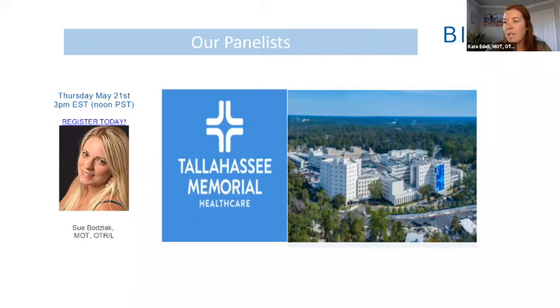Just to start, can you tell us a little more about yourself, your clinical background, and then your facility and the patient populations that you treat? Sure. So, like I said, my name is Sue. I was in the video. So I work in the outpatient neurological unit at Tallahassee Memorial. I've worked here for 4 years now.